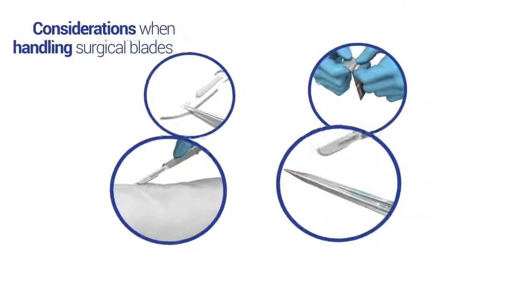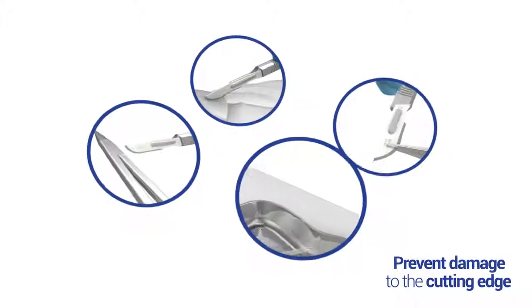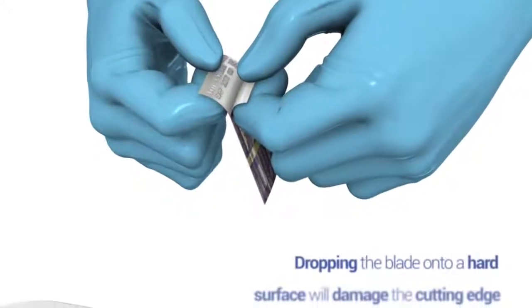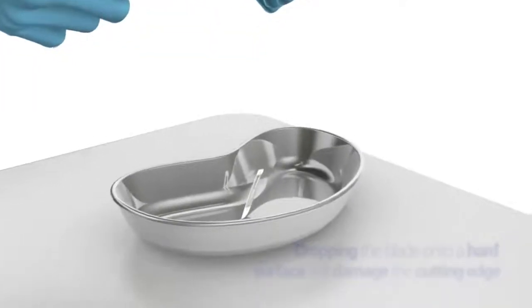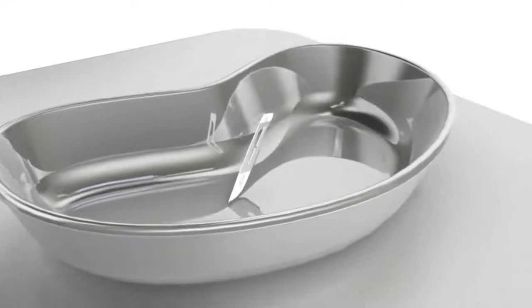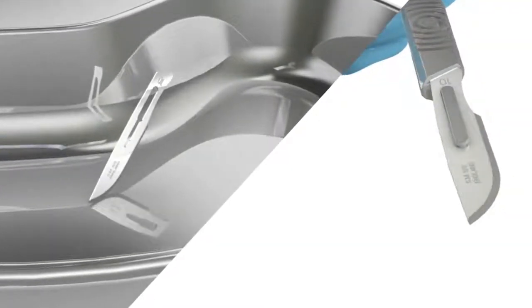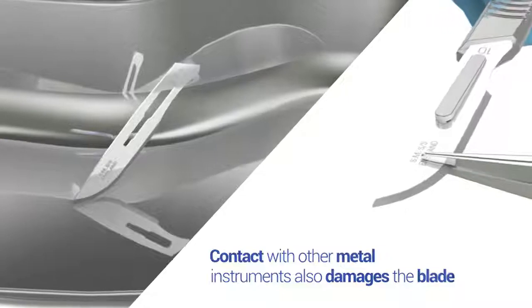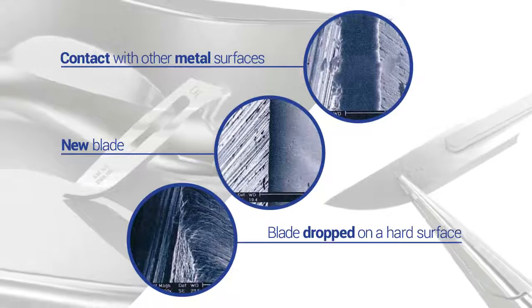There are a number of considerations when handling surgical blades which can prevent damage to the cutting edge and thus reduced cutting performance. When removing the blade from its protective foil packet, make sure it's not dropped onto a hard surface or into a metal kidney dish. When the cutting edge comes into contact with objects such as metal bowls or containers, it can significantly diminish the initial keenness of the cutting edge before it's even been fitted to the handle. Once fitted to the handle, contact with other metal instruments can have a similar detrimental effect. The reasoning becomes clear when we look at high-resolution images under magnification of the damage which has occurred when a blade is dropped into a metal dish or caught on a surgical instrument.